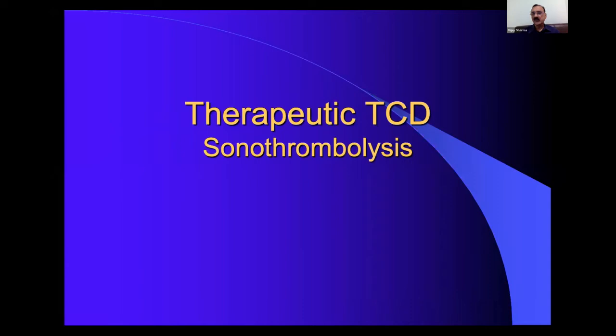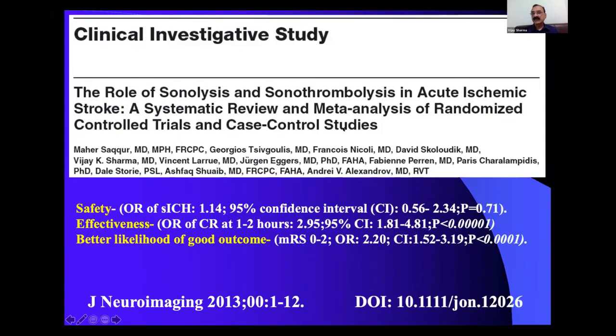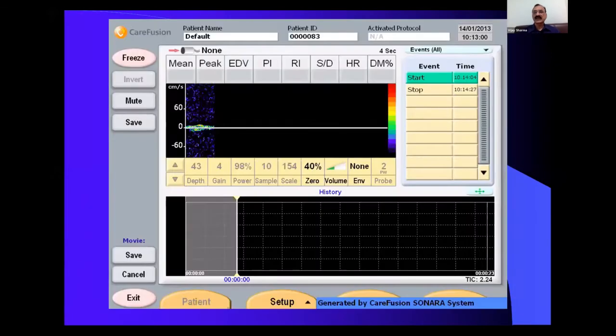Therapeutic, I'm not going to talk much about it. It is still a technique in development, except the landmark trial showed that you can increase the chance of recanalization in severe cases by nearly 1.5 times. Reviews and meta-analysis showed that it is a safe procedure, it's an effective procedure, with better likelihood of good outcomes. Everything looks good, but we need to prove it in larger clinical trials.